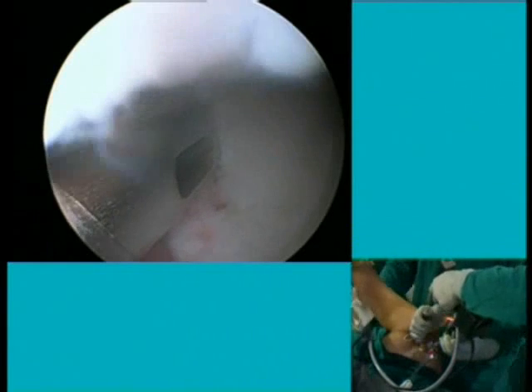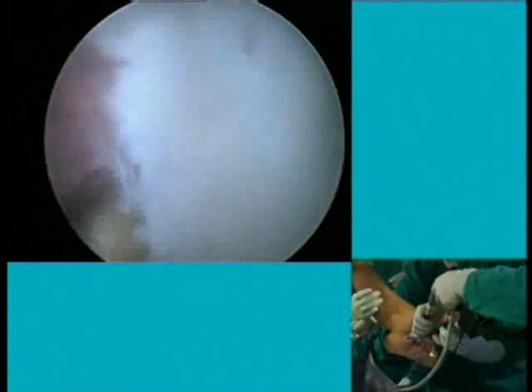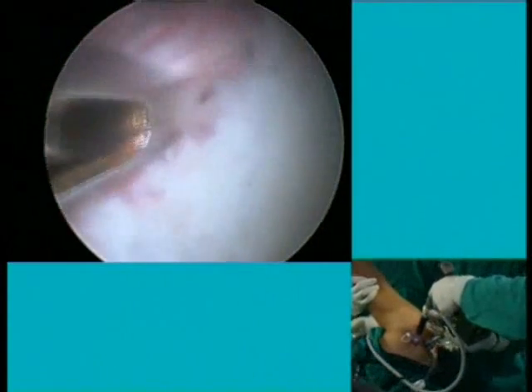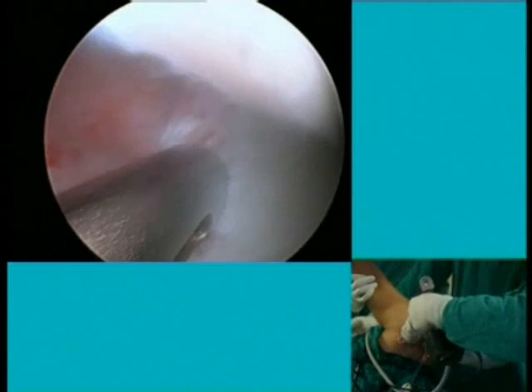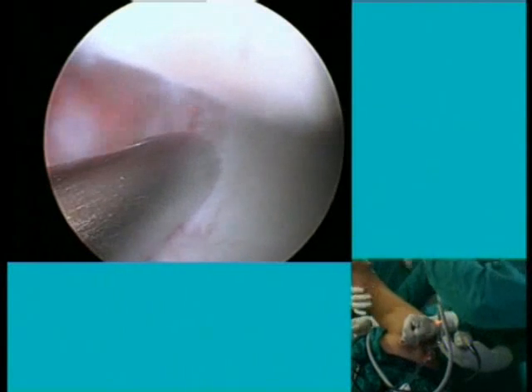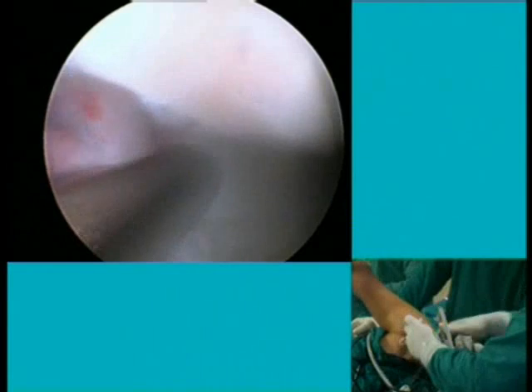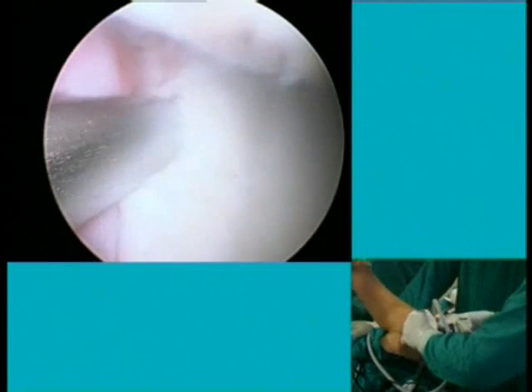Does it have an auto stop? It has a laser mark here. If the cameraman can focus on this laser mark outside. Okay, while this was happening, my sheath moved, so I'm going to reposition that now. Just hold on, bear with me one sec. Okay, I'm happy with that.